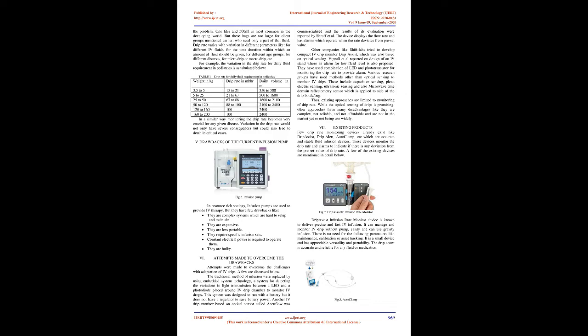Intravenous fluids are to be given at a specific rate, neither too fast nor too slow. The specific rate may be measured in drops/min, ml/min, ml/hr, liter/hr and others. Importance of drip rate. The following are the reasons why drip rate should be monitored. The drip rate set by the nurse can change due to various reasons. A few are listed below.